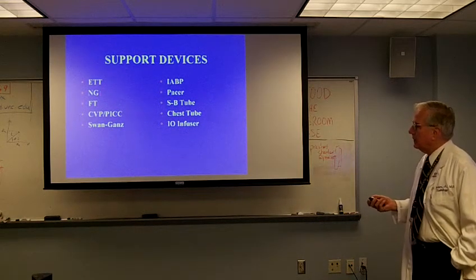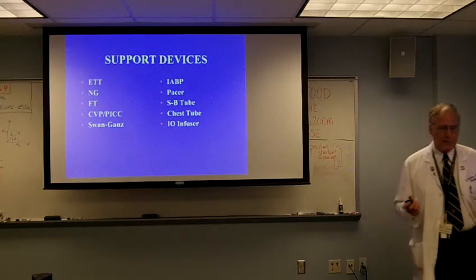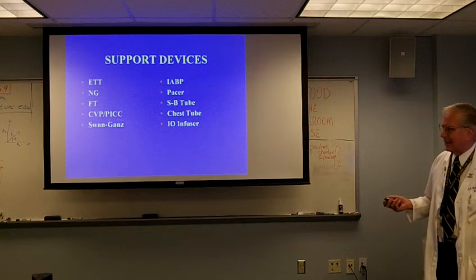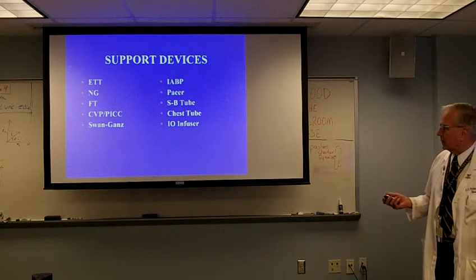Nasogastric tubes, feeding tubes, and I put in CVPs and PICCs just because they're so ubiquitous that you need to have some idea of where they ought to be properly positioned. Swan-Ganz catheters. You all know about Swan-Ganz catheters? Okay, we're going to talk about those a little bit.